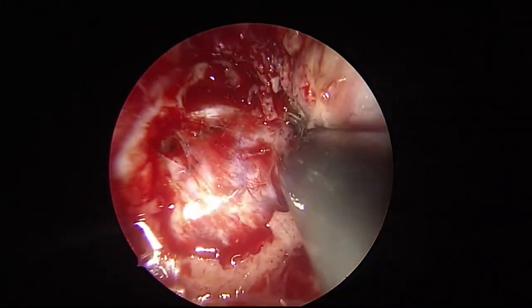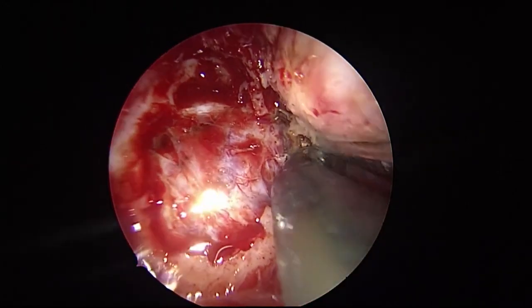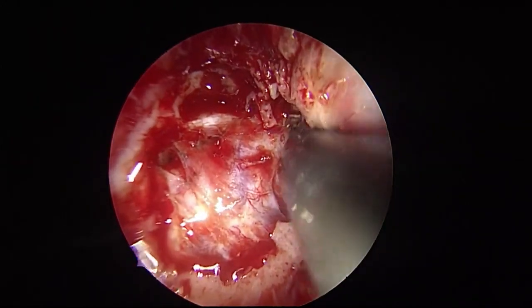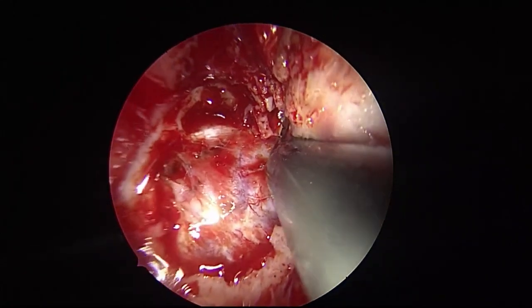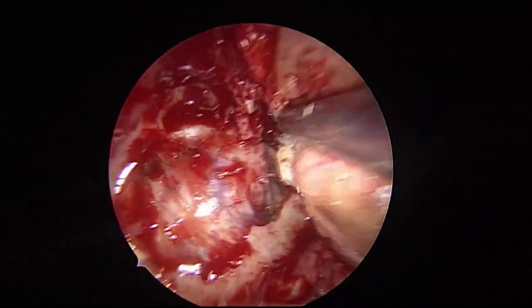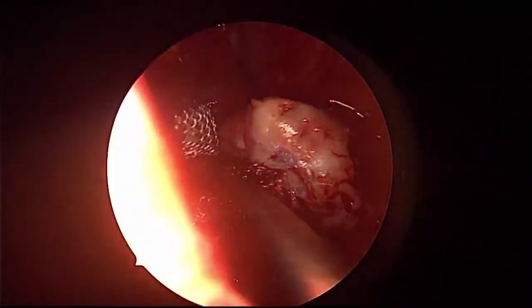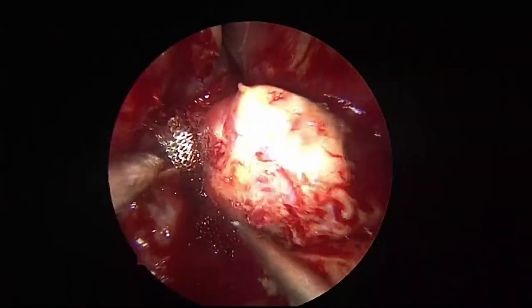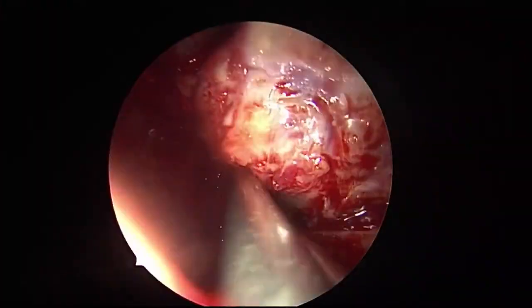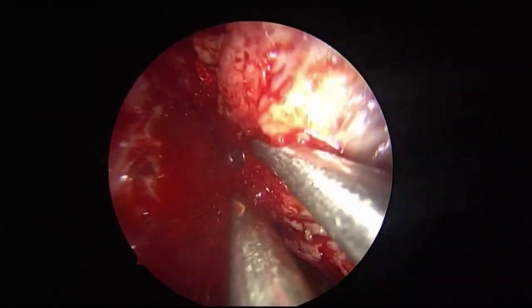See the medial removal of the bone. Yes, sir. I'll leave a small piece of Surgicel on the raw surface because it keeps on oozing otherwise.